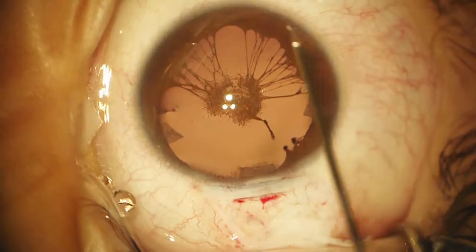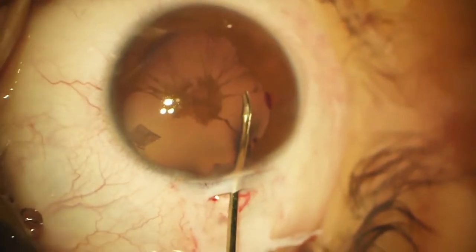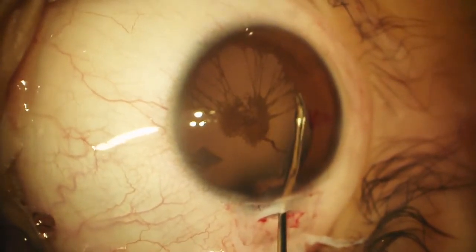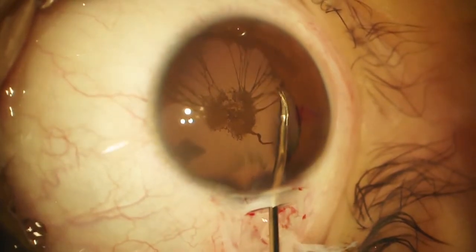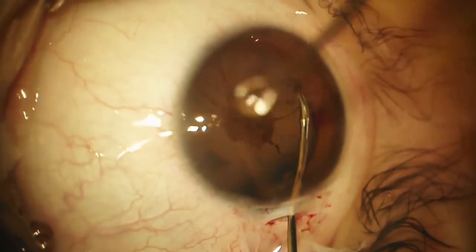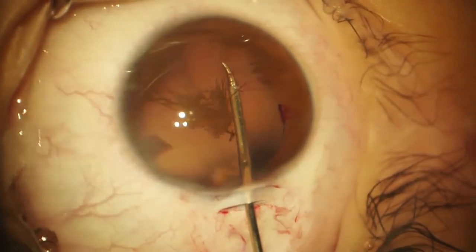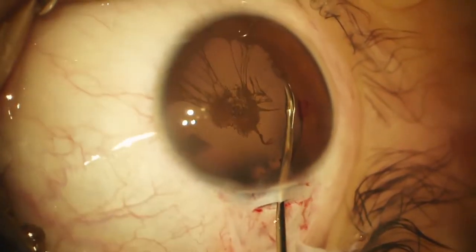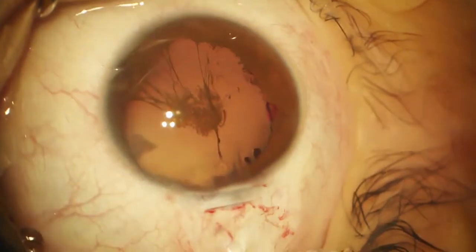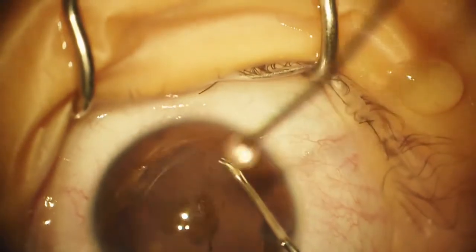These are disposable micro scissors with very tiny little blades. We're just going to walk around and cut all the strands off right at the edge of the pupil. We have to be very careful to avoid hitting the capsule, so I'm lifting up every time I make a cut. One left over on this side. The scissors is so small that it will fit through a paracentesis.